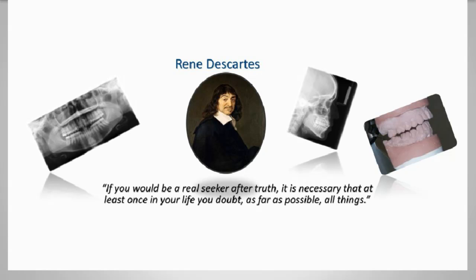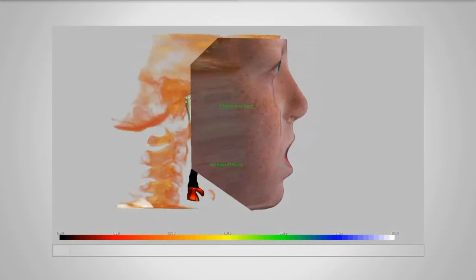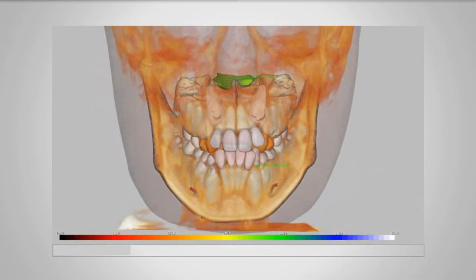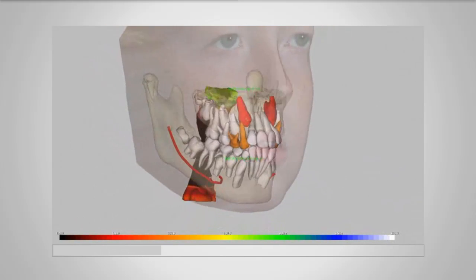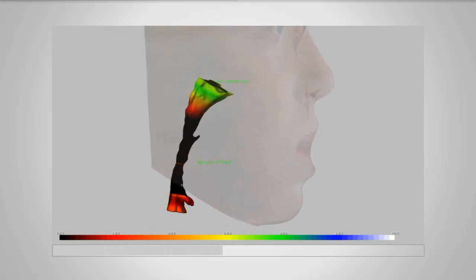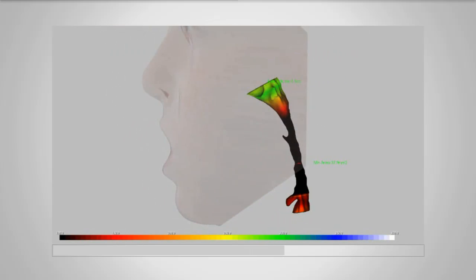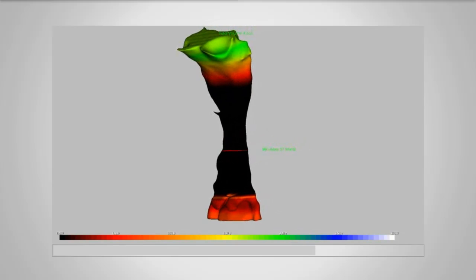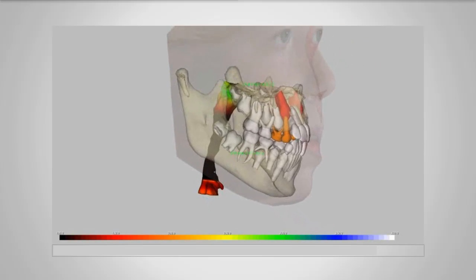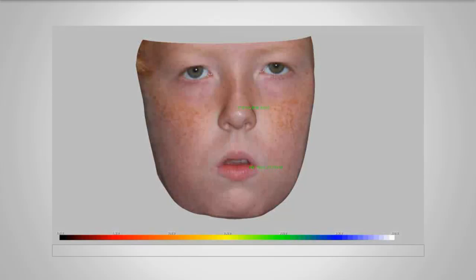Cone beam CT now allows us to visualize patients in a much more holistic manner, bringing to light the very essence of the head and neck, which is the pharyngeal airway. And so we can now visualize the air spaces on every single patient through computer power, and make decisions and assessments about different sizes, shapes on patients' airways, and better understand their relationship to what we do.